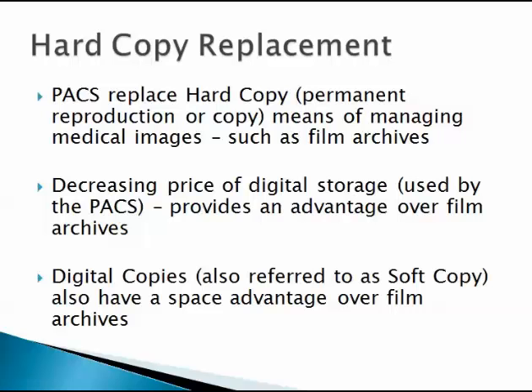So, there's hard copy and soft copy. A hard copy would be an actual x-ray. A soft copy would be the digital copy.